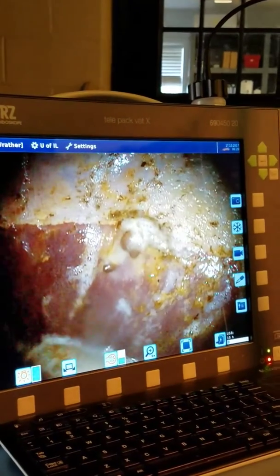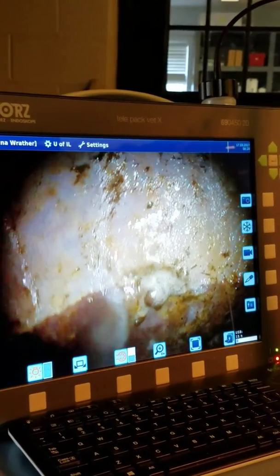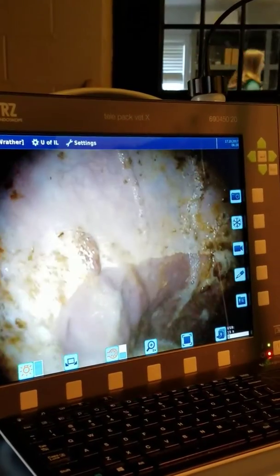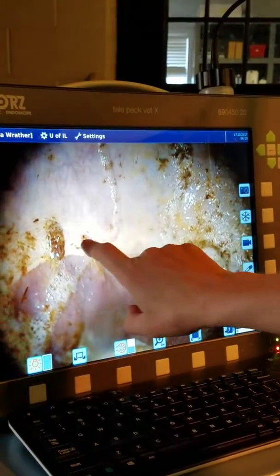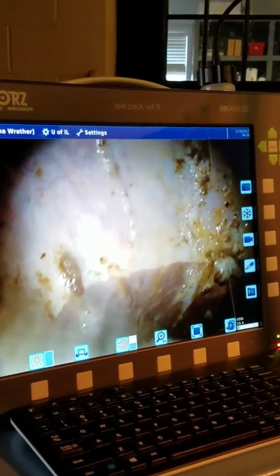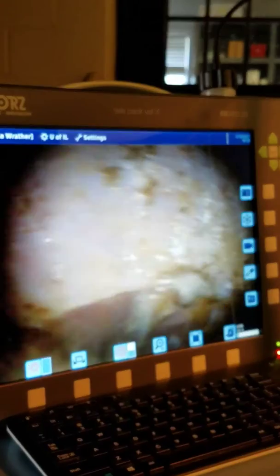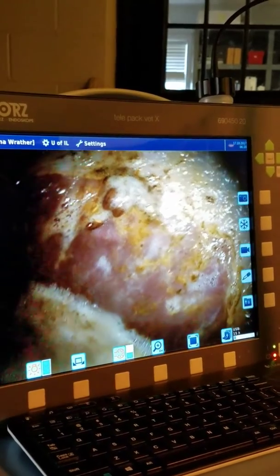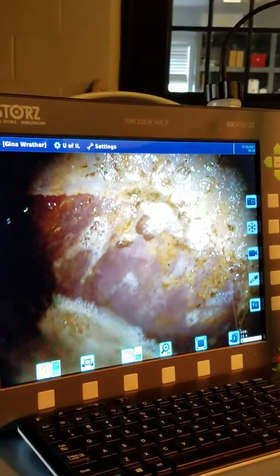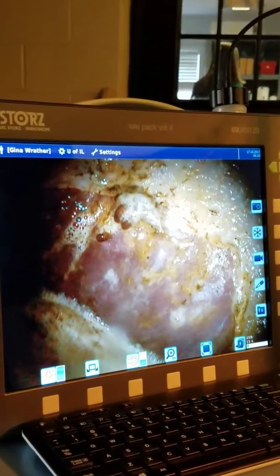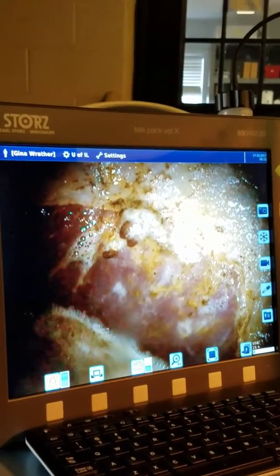Those are little bots — bot larvae. It's not a big deal; everybody's going to have them, especially this time of year. But what we're looking at is right here along this line — that's a common area for ulcers. Do the bots in and of themselves create an ulcer? Usually not.